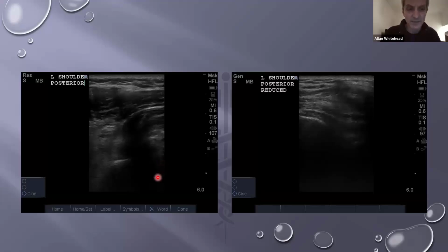This is an anterior dislocation coming from behind the patient. So the humeral head's actually down here and the glenoid fossa's here. Now, not the best picture, and there'll be others that you'll see it more clearly. So this is sort of the space where the head used to be, and it's further away from the probe because the head has moved anteriorly, but our probe is placed posteriorly on the person. So the head, when it moves anteriorly, is further away from the probe. Therefore, it's deeper in the screen.